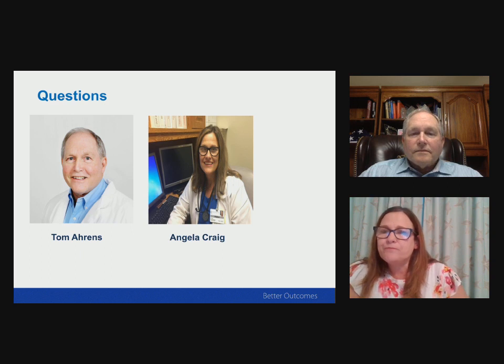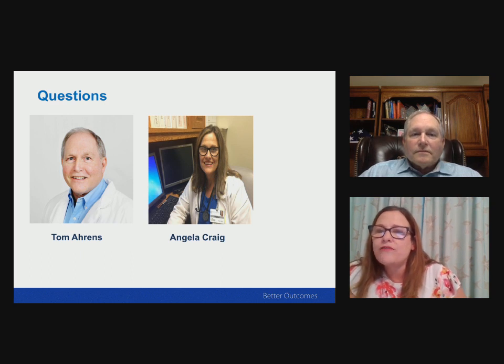Exactly. So thank you for that. Now, somebody brings up, and I know we only have time for just a few more questions, but I want to address this. It says, in CPR resuscitation, the end tidal CO2 value is more valuable because the capnogram waveform is challenged to see and use due to compressions. Now, in my experience, it is very important that I see that waveform, and I don't like to trust a number without a good waveform.